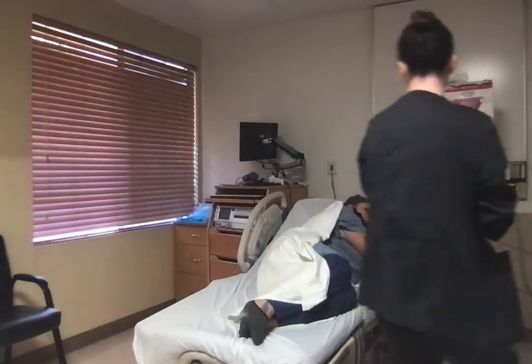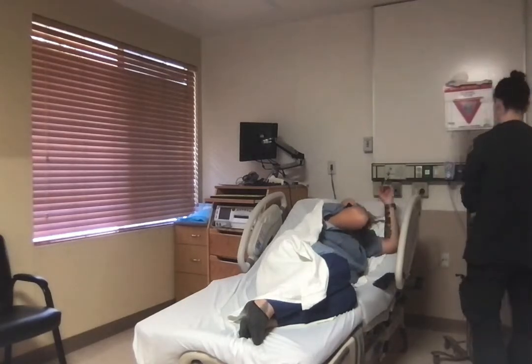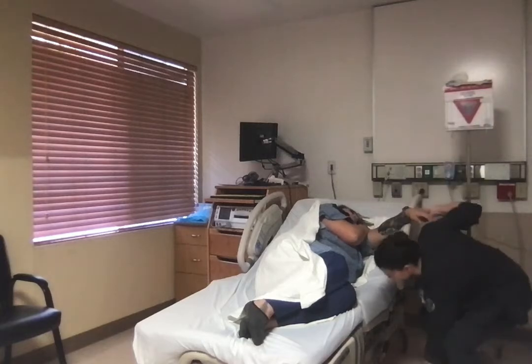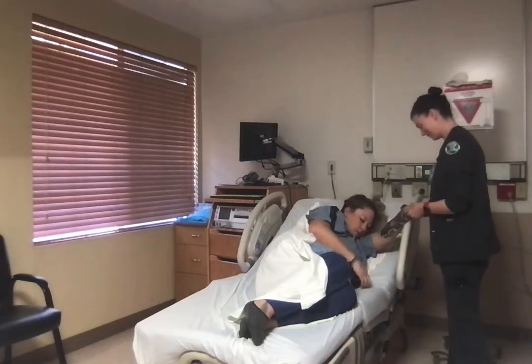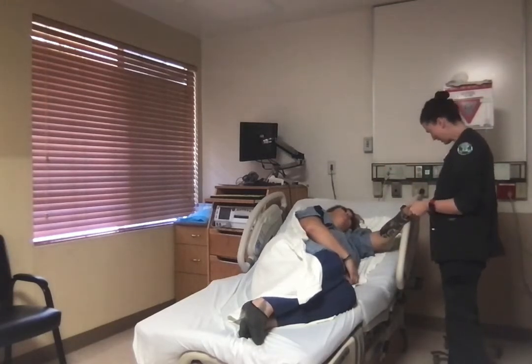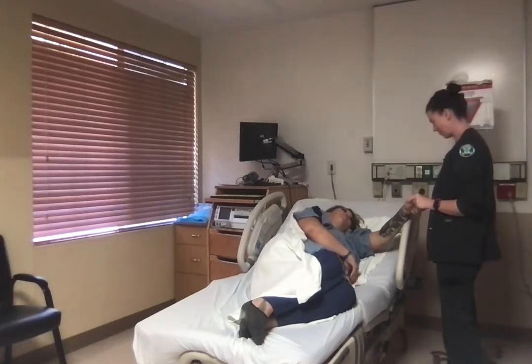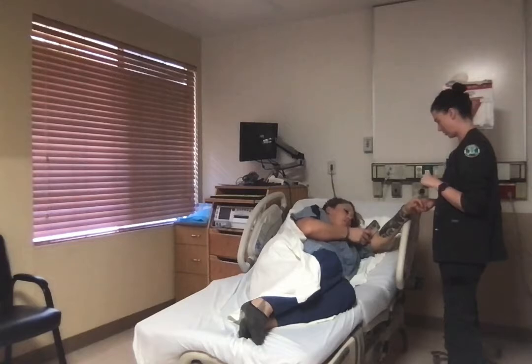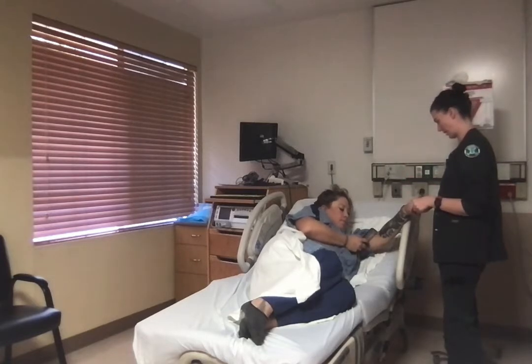Hi, Mom. I know you're resting. Can I have your name and date of birth again, please? Katie O'Connor, 2001. Thank you, Katie. So baby's heart rate is improving, but I did just want to give you some more fluids, and that should be the last boost we need to get his heart rate back where it should be at.